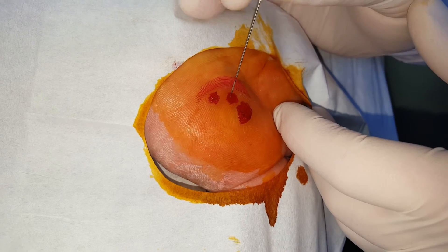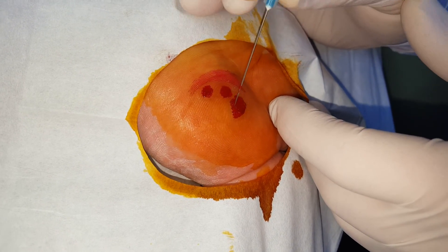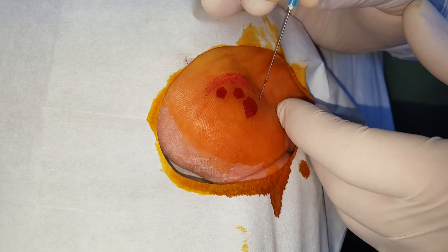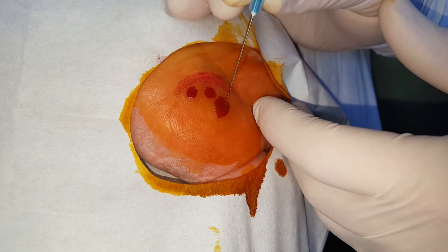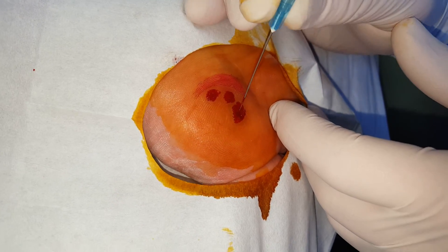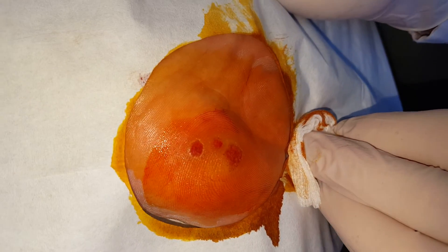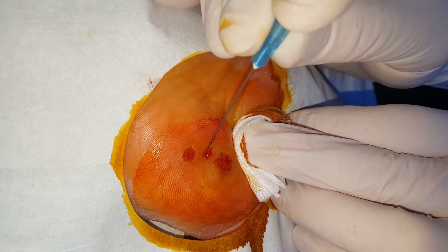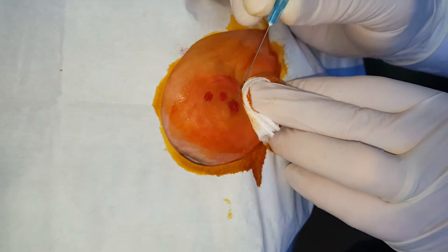We're going to get the last few of these and then over to this one a bit more. You can feel the areas — where you've gone through before there will be less resistance. You're just trying to get a number of different angles on this to make sure the whole wart is being needled. We'll just wipe that up and you can see what it looks like — it'll bleed a little bit, but you're really just poking holes in these warts so that we get the virus into the bloodstream, so the body recognizes it and gets rid of it on its own. And that's all there is to it.